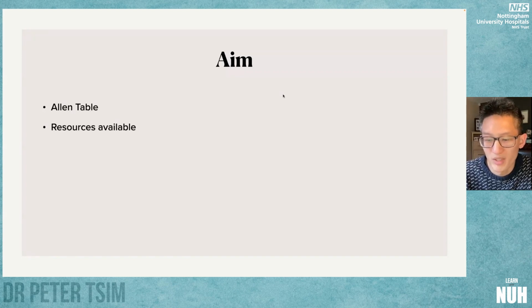That's basically everybody who does any general on-call at NUH, because spines emergencies come out of hours, and often when those ones do, they can be unstable or difficult. In this situation, the Allen table is really useful for proning and will be a great friend if we know how to use it properly.